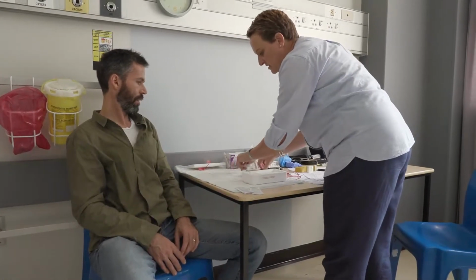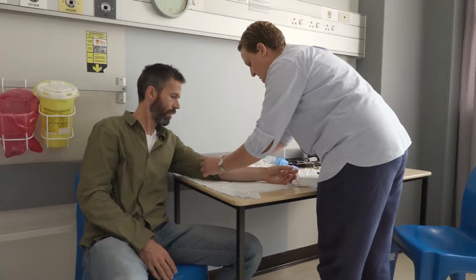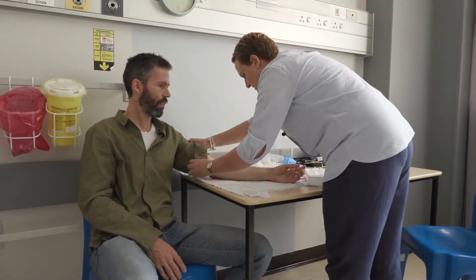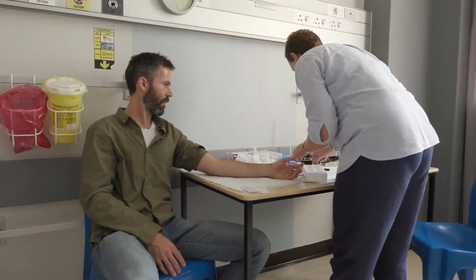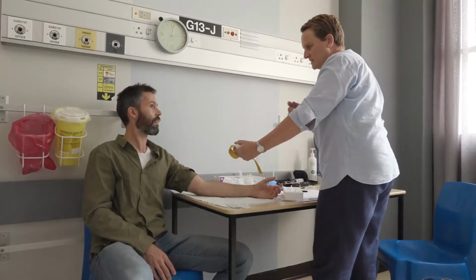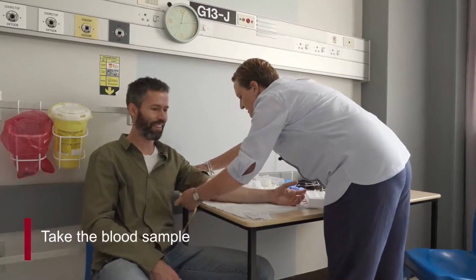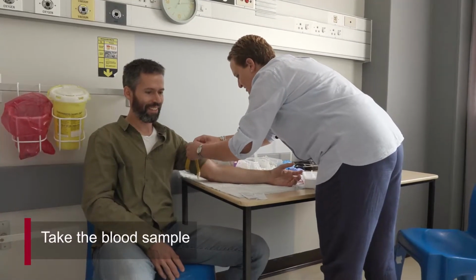Can I borrow your left arm? Yes, doctor, you can. Thank you. Let's see, I'm just going to put up your sleeve. All right. There you go. Will this hurt, doctor? It's going to hurt a little bit, but it's only like a small scratch. It's only for a few seconds. Okay, I trust you. Thank you. I only need to get 2 teaspoons of blood.